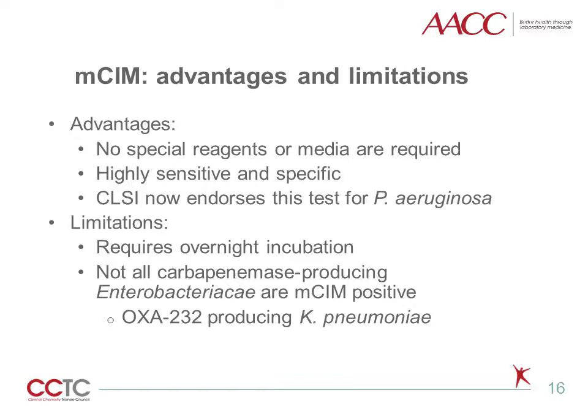The advantages to the mCIM test are that no special reagents or media are required, and it is highly sensitive and specific. Additionally, CLSI now endorses this test for P. aeruginosa. However, the mCIM requires overnight incubation, increasing time to results, and not all carbapenemase-producing Enterobacteriaceae are mCIM positive. For example, one isolate of OXA-232 producing Klebsiella pneumoniae was negative by this assay at some validation sites.